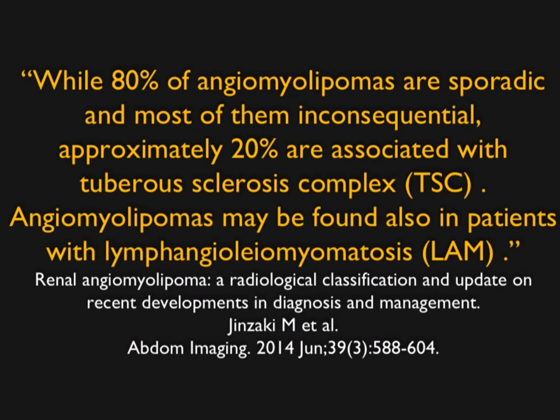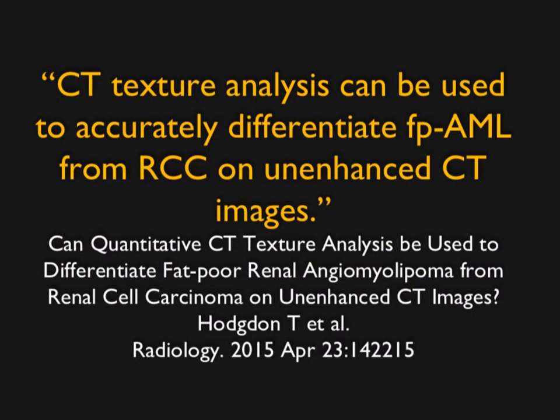Again, this whole idea about syndromic versus incidental becomes very, very important. And people have used that also with texture analysis to figure out, is something an AML or is it an RCC based on non-contrast scans? And they've had some success doing that.